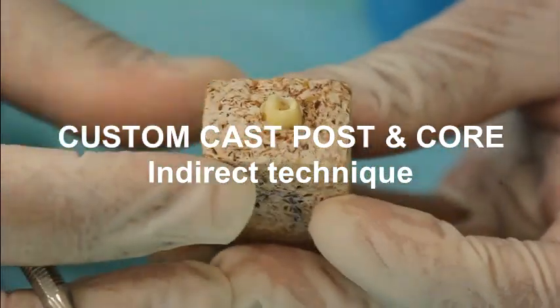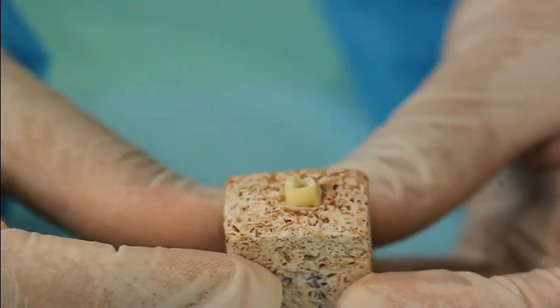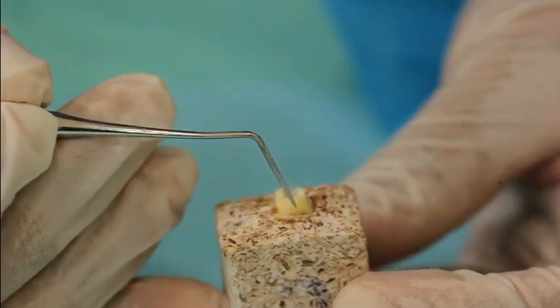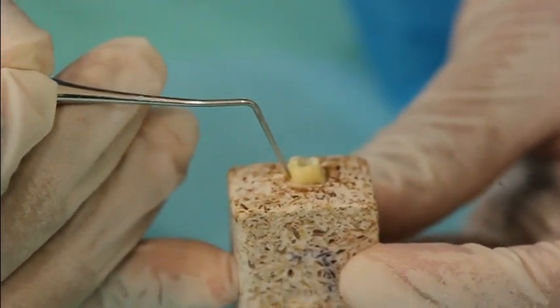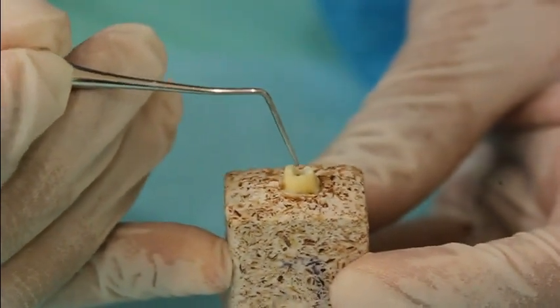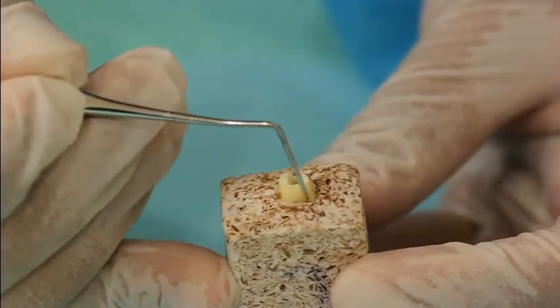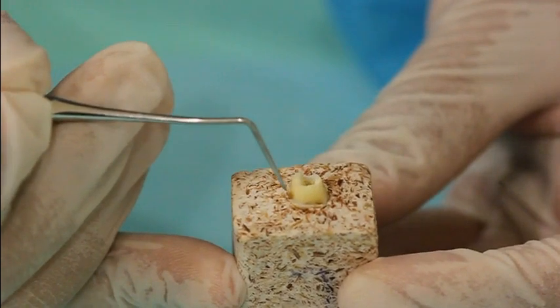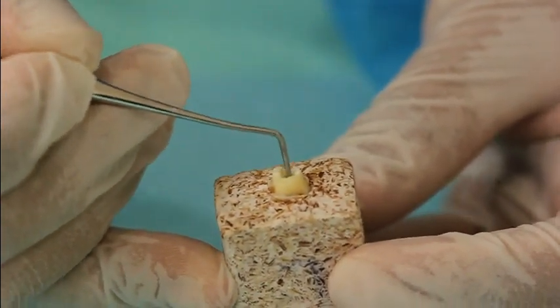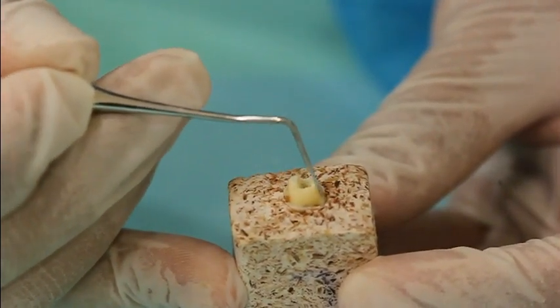Okay, now for preparation of post for indirect technique. The indication for doing indirect technique for post and core depends on availability of the tooth structure on the crown prep. So if the tooth is indicated for custom-made post and core, once you prepare the canal part, you have to prepare the margins of the crown as well.